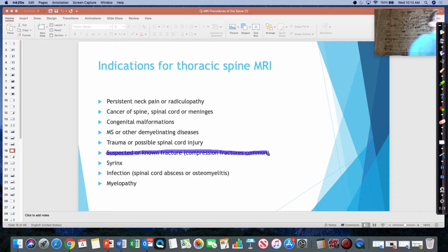And you're going to be assessing those patients, and it's really hard to get your patient on a table when they have extreme kyphotic curve. So a lot of times you have to really boost up their lower body to lay their back flat onto their MRI table. So you're going to be using a lot of pillows, but then you're working against it, their feet are going to start to hit the top of the magnet. So you're going to have to find a good in-between to make them comfortable, to get through that 30 to 45-minute scan, but then to also get their spine as close to that phased array coil as possible.